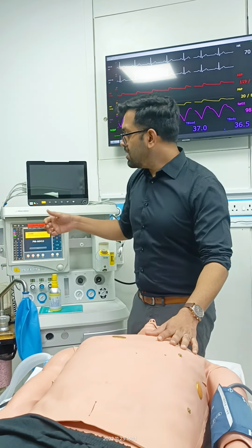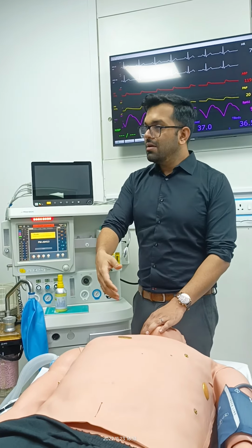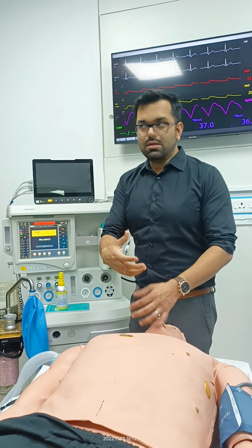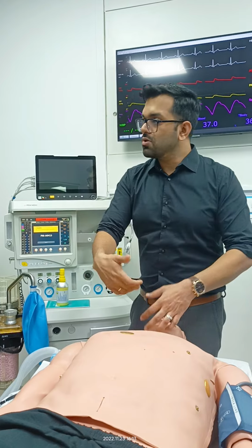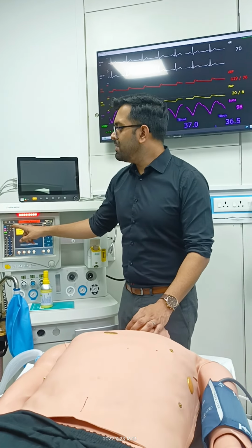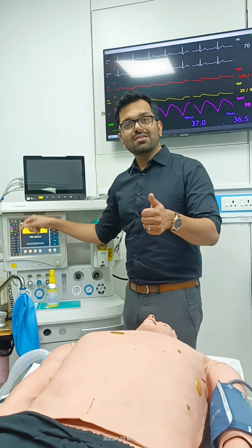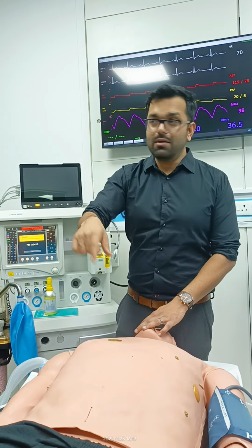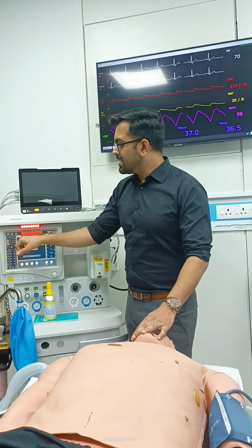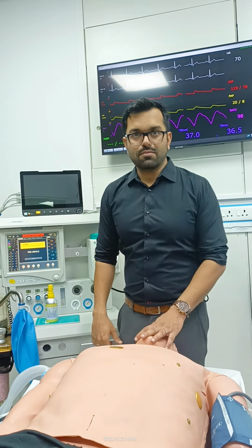The agent which is already accumulated in the body has to come out, so you'll see that expiratory concentration is still present and it's falling, because you're not giving anything to replenish it. Once it falls to a critical level, you know that the agent has come out.